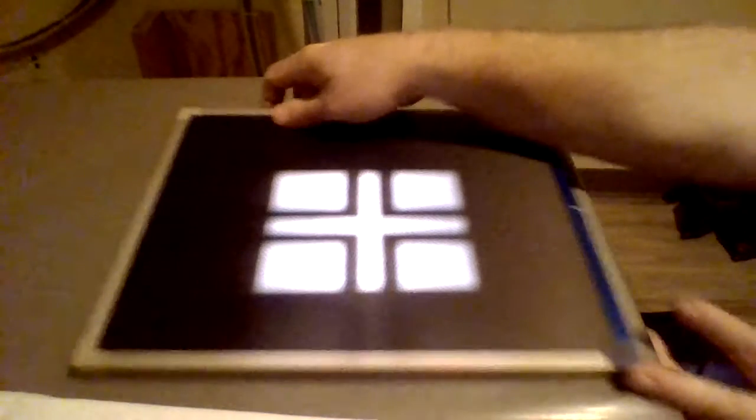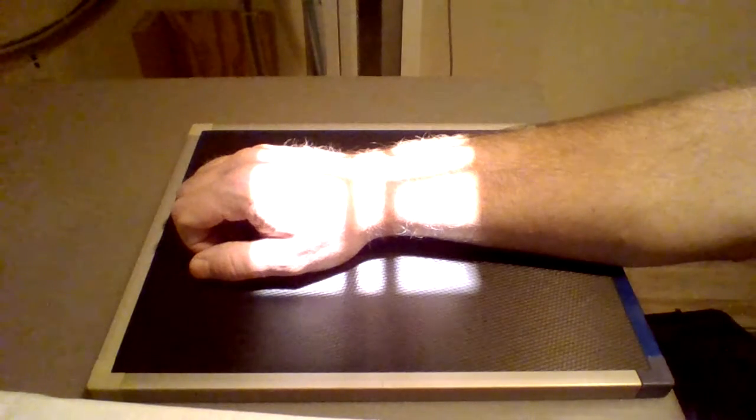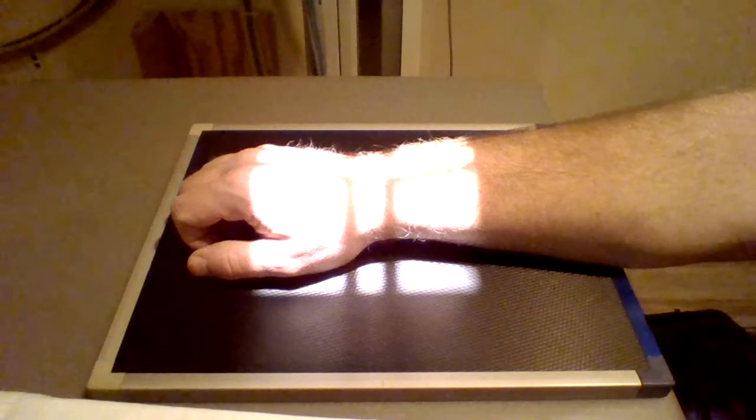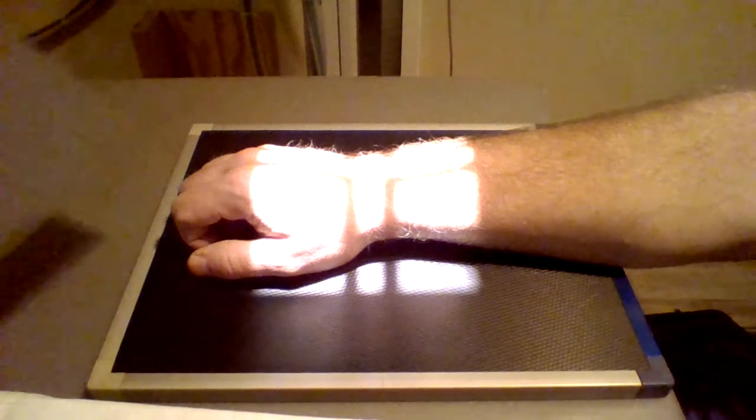We're going to be using a 10x12 cassette lengthwise, kVp of 64, and a 4 mAs. So you're going to align the patient's wrist with a portion of the IR being exposed, and we're going to rotate the wrist and hand laterally at a 45-degree angle, using a sponge to support the wrist.